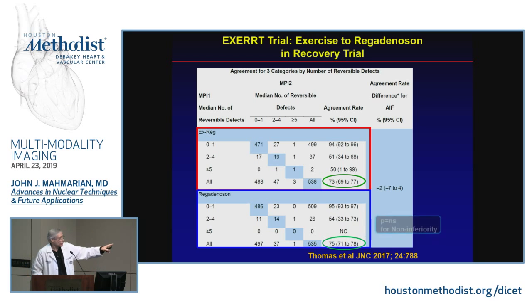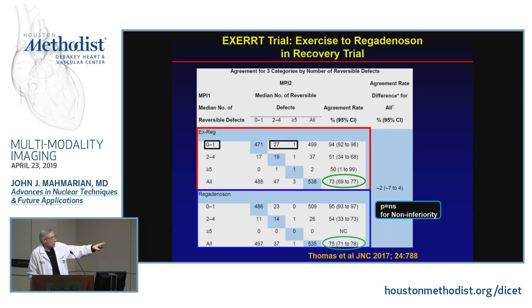What was interesting about this study was actually the number of people who actually got worsening ischemia on the second regadenoson stress study, because on the first study, everyone got rest first, followed by regadenoson second. And on the second study, they simply got regadenoson stress. And what this shows is that when you do rest imaging first, you can mask ischemic perfusion defects, okay? Which is one of the reasons why, among other reasons, that in our laboratory, we do stress first to maximize our ability to detect ischemia.